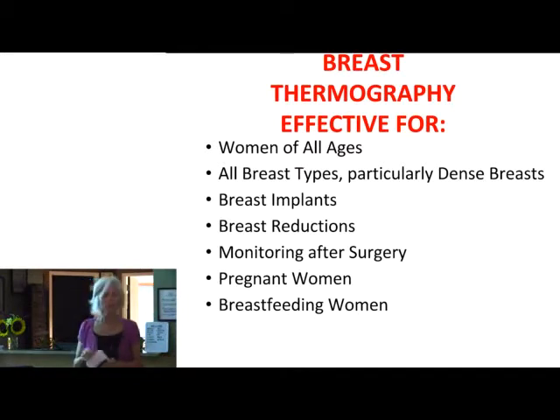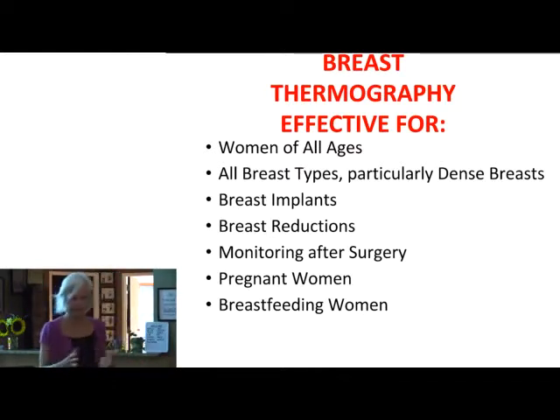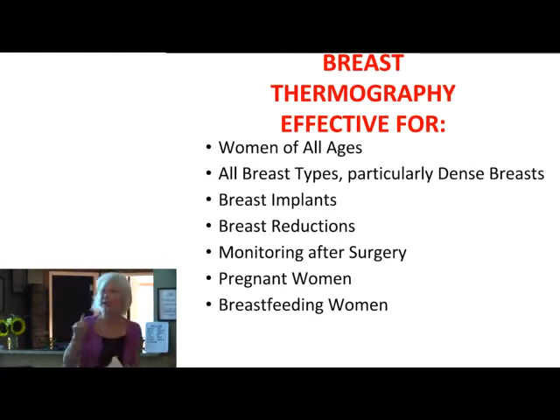Monitoring after surgery. If someone is going to go through surgery for breast cancer, whatever treatment they decide they want to do, whether conventional or not, a thermogram is good to see what it's like right now. And then after the therapies, whatever they are, monitor to see if the therapies are working, whether from chemotherapy or surgery afterwards. Is the heat different? You have to heal from the surgery, but with any kind of therapies, it can help you monitor what it's looking like as you make improvement.